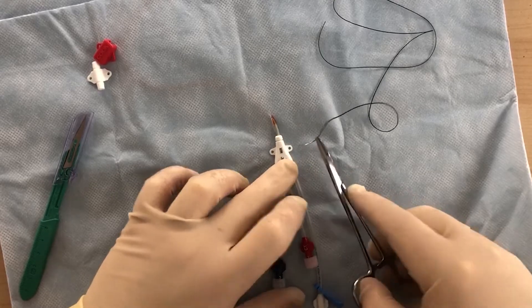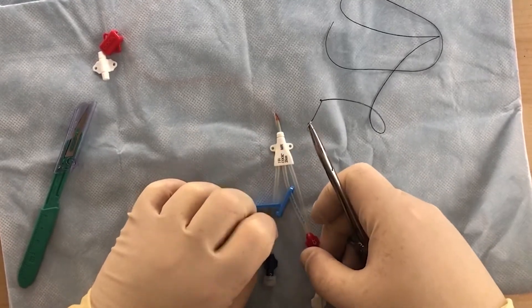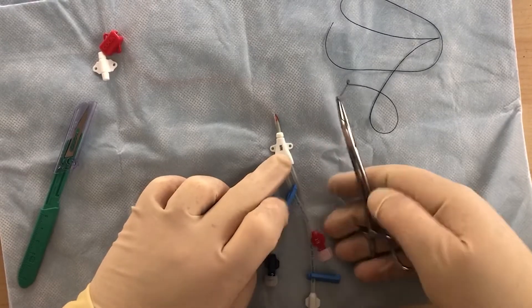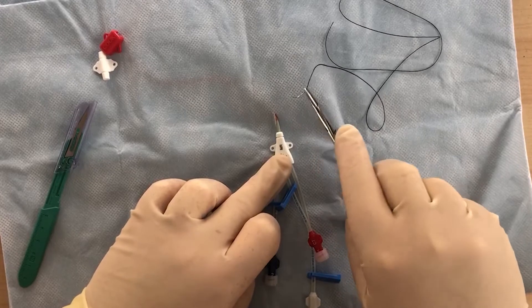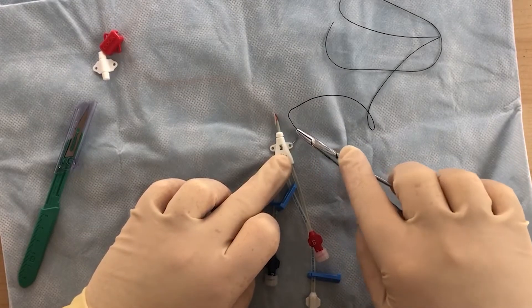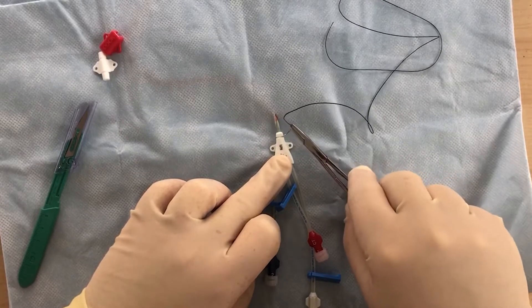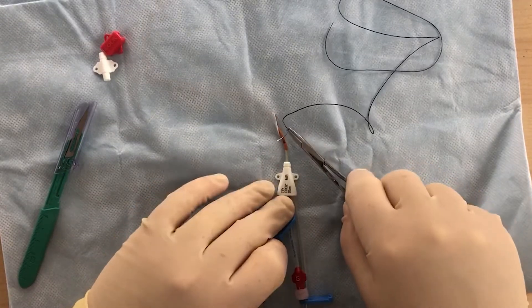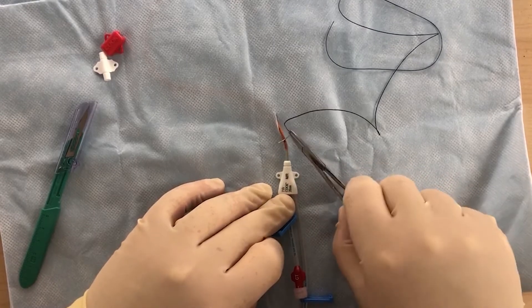This provides a little mechanical support if something pulls on the catheter itself, so the hub doesn't move and pull the catheter out. This one actually secures the catheter from moving in and out, because usually you have a little bit of slack when you do it. So it's important to do these two and the third one, and if there is extra catheter space you can secure it to the catheter itself by purse-stringing it.